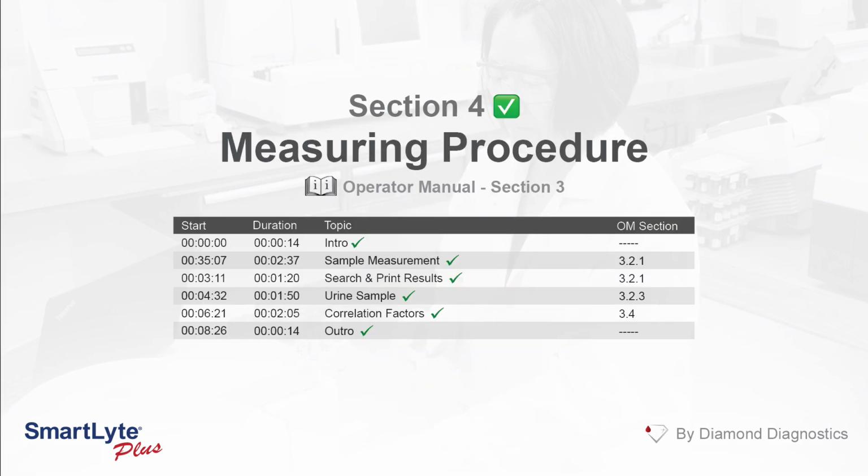This concludes Section 4, Measuring Procedure of the SmartLyte Plus training. In Section 5, we'll be discussing the veterinary mode.